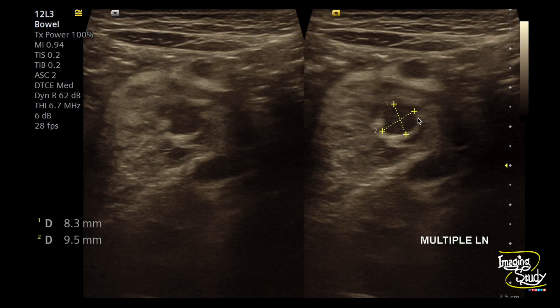Here's the picture of the lymph nodes. Prominent hypoechoic oval and round lymph nodes are seen adjacent to the abscess.